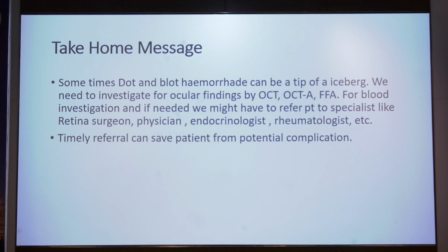In the take-home message, sometimes dot and blot hemorrhages can be the tip of the iceberg. We need to investigate for ocular findings by OCT, OCTA, FFA, and for blood investigations. If needed, we might have to refer the patient to a specialist like a retina surgeon, physician, endocrinologist, or rheumatologist. Timely referral can save the patient from potential complications, because as I told, it can be the tip of the iceberg.